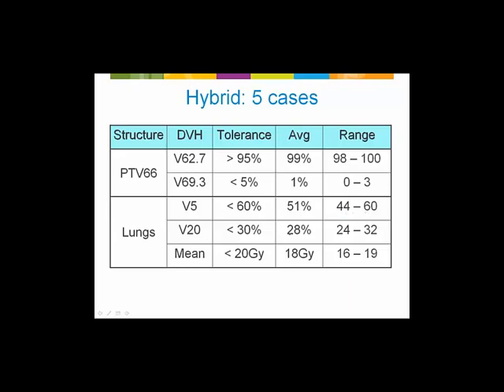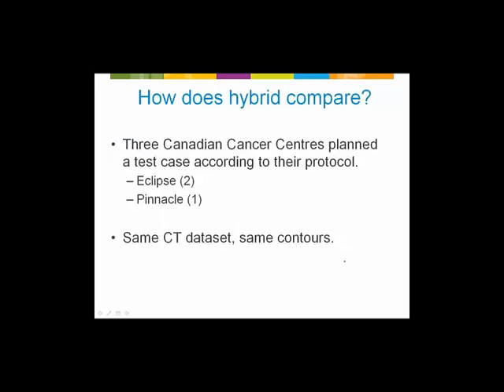And then one site was a Pinnacle site with Elekta Linac. Same data and same contour. So I took one of the very challenging cases that we had and sent the data and the contours and nothing else, no information about how we might have planned this, and just said, plan according to your technique for 66 Gray in 33 fractions.